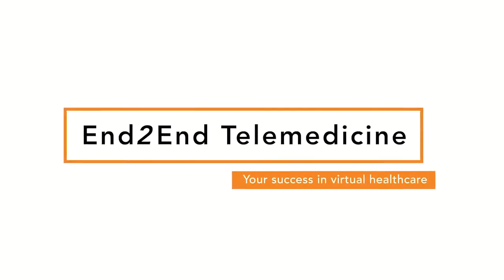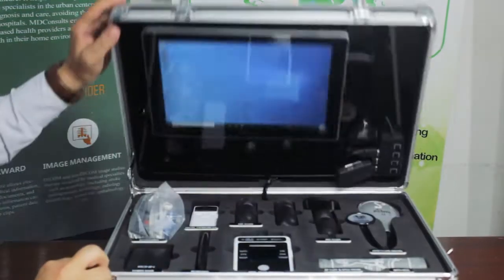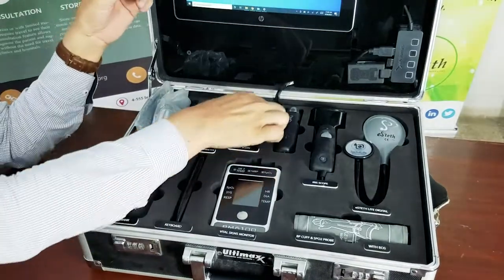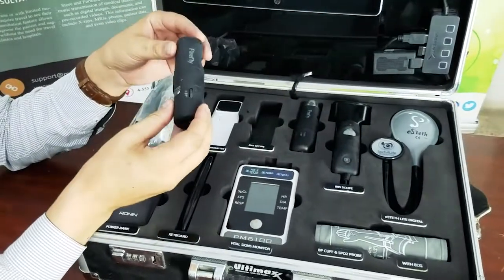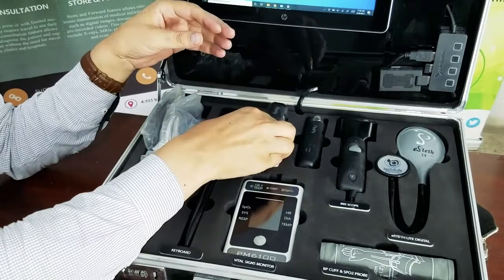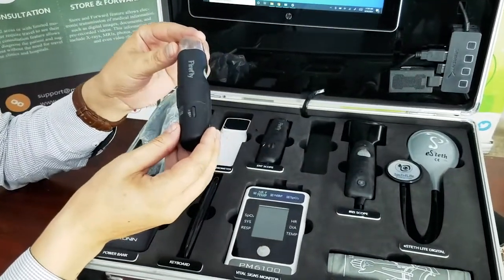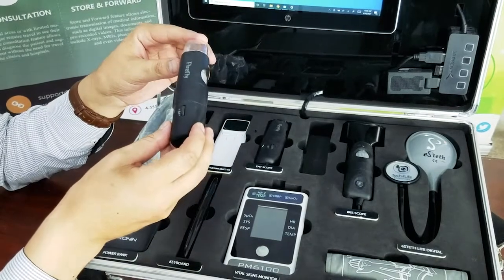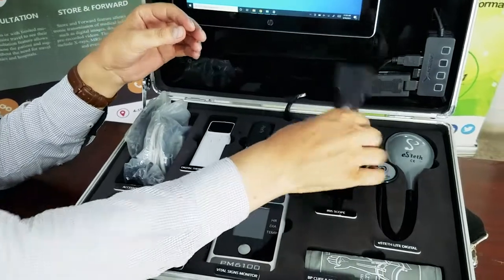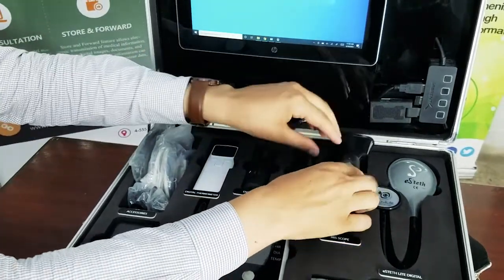We are happy to introduce you to the Sojuro telemedicine kit. The kit is equipped with a number of devices, including the otoscope, which is a wireless device, a dermoscope, which is also a wireless device for the Sojuro COVID kits, and an iriscope, which is a wired device.